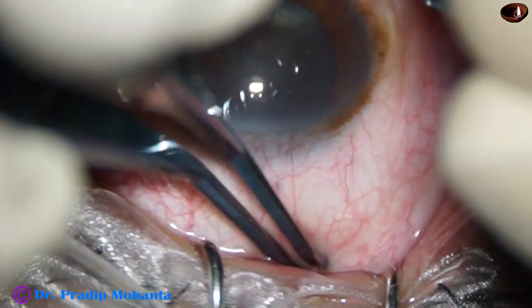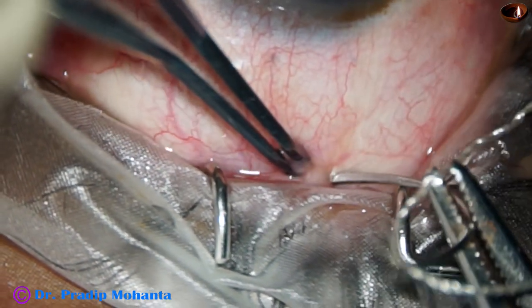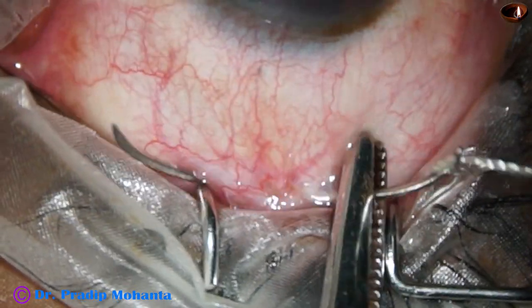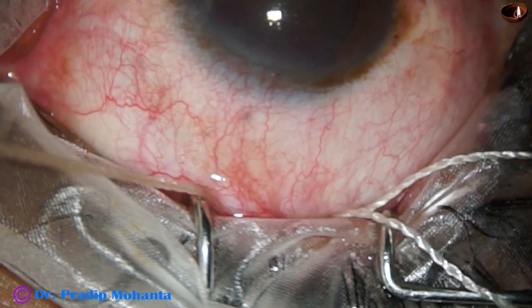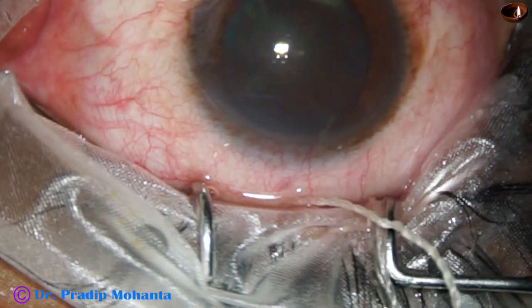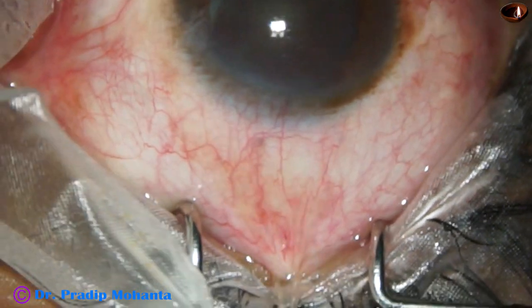This is how the superior rectus bridal suture is placed. The eyeball is retracted downward with the help of a muscle hook, and the superior rectus bridal suture is passed. This will make the eyeball stable in many steps, like making the incision, making the tunnel, conjunctival peritomy, and many other steps.